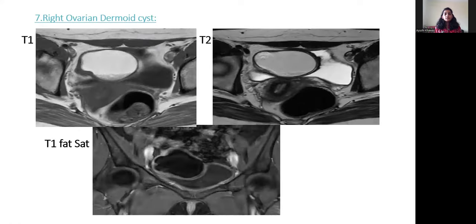Seventh case: right ovarian dermoid cyst. T1-hyperintense and T2-isointense, more towards hyperintense. T1 fat-saturation image shows fat saturation, confirming this is a dermoid cyst.